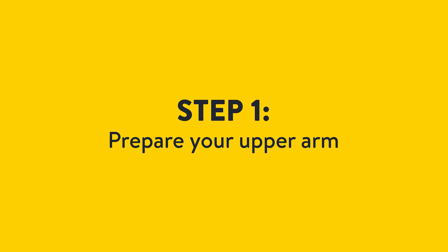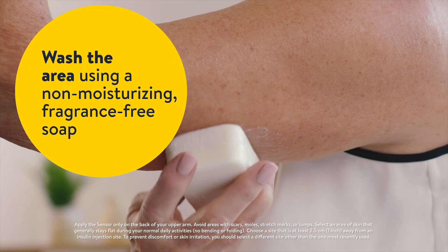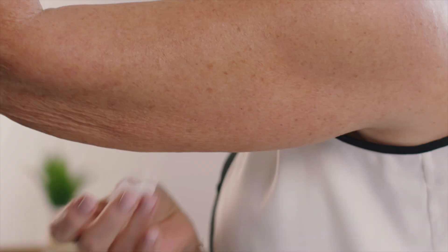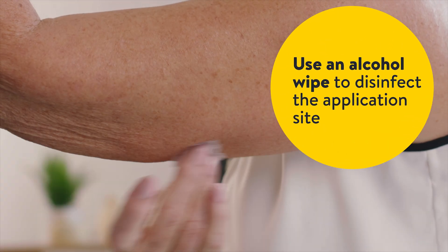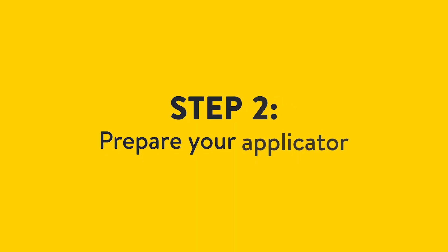First, you will prepare your upper arm. Wash the area using a non-moisturizing, fragrance-free soap. Use an alcohol wipe to disinfect the application site. Allow your skin to fully dry prior to applying your sensor.